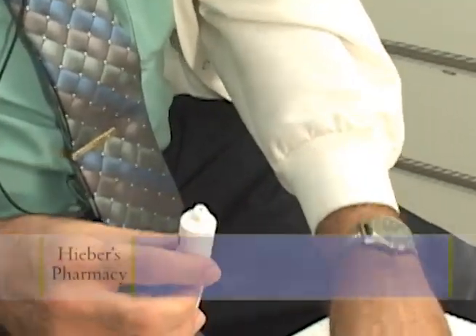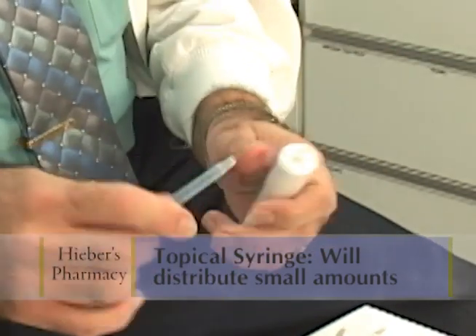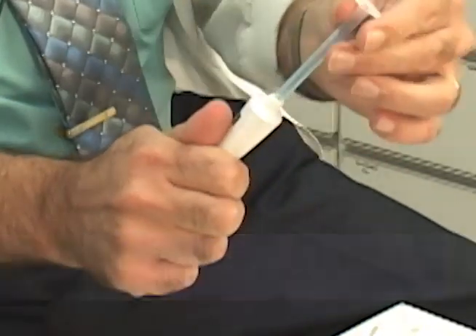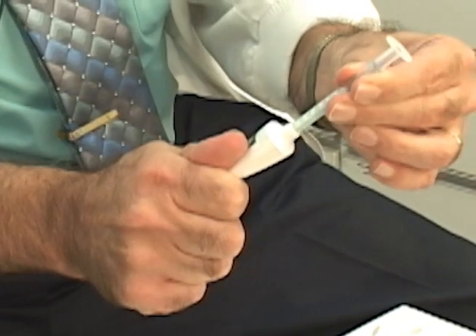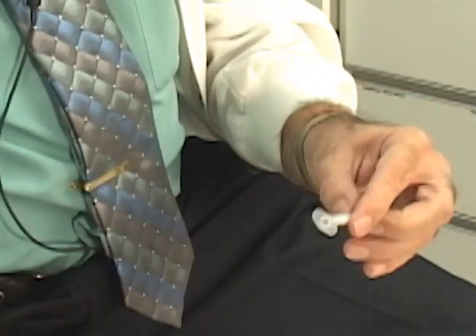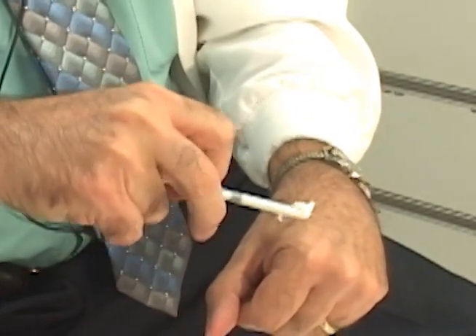Alternatively, we have the topical syringe which inserts easily into a tube. Taking the plunger out of the barrel and then squeezing — holding the barrel firmly and then squeezing the cream up to the 1 ml mark, taking it out and then reinserting the plunger and squeezing, expressing the cream out.